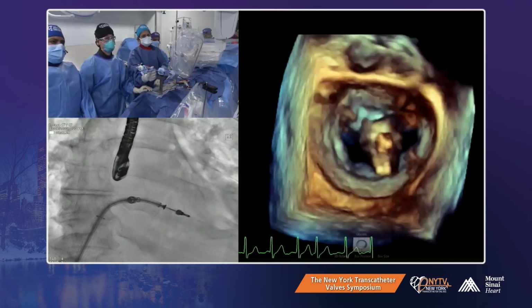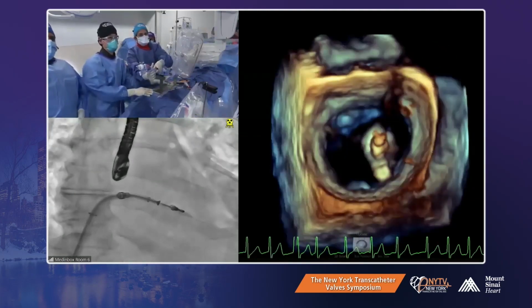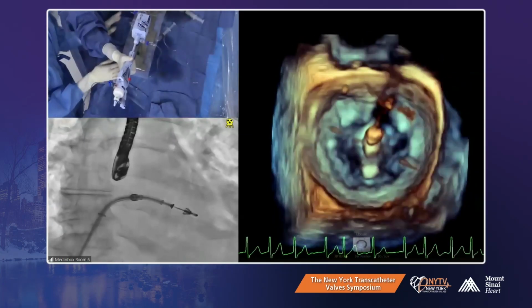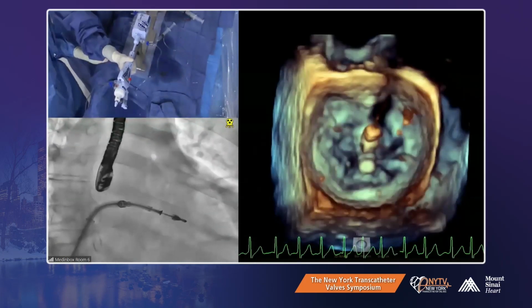Okay, so it looks like we need to clock a little bit more on top. Central maybe. You have to clock a little bit. You are still in the middle. You are in the very good middle there. Yeah, you're very central there. And now fix the... Watch the anesthesia, watch your feet.